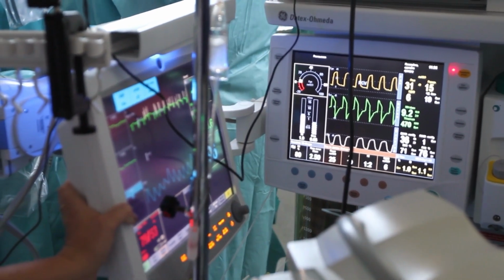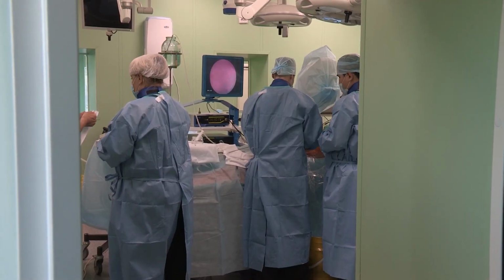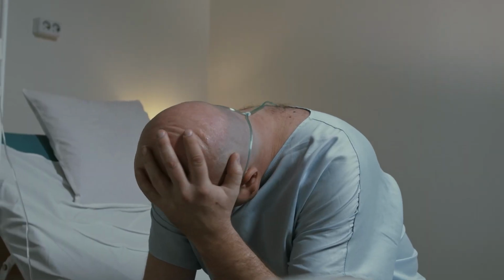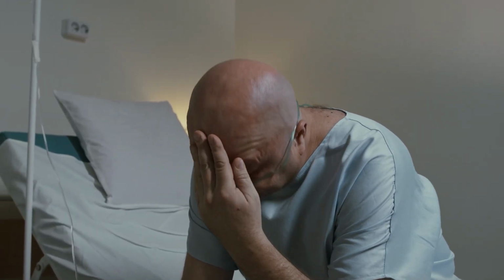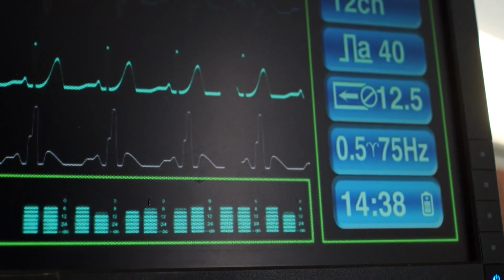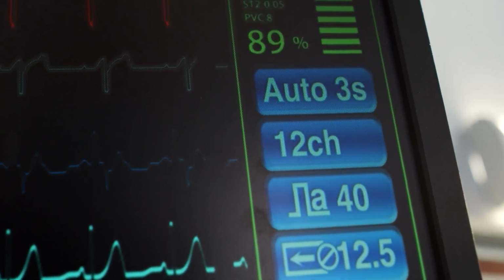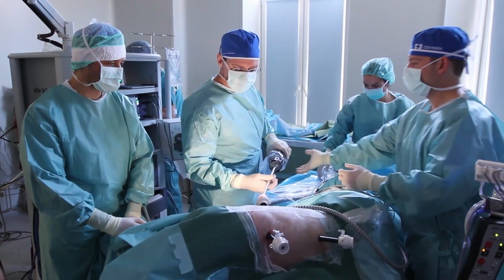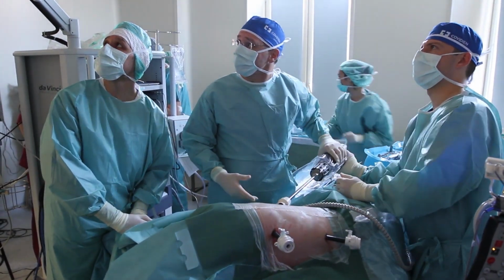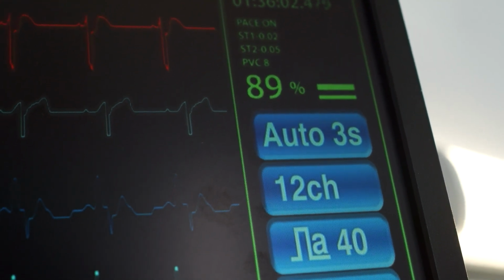The presence of this backdoor introduces significant risks in regards to patient safety. A compromised device could lead to improper responses to vital signs, potentially endangering patients. Then data privacy: patient information is being transmitted to an unauthorized server without the knowledge of healthcare providers. And device integrity: the backdoor allows for remote modification of the device's configuration and execution of unauthorized code.